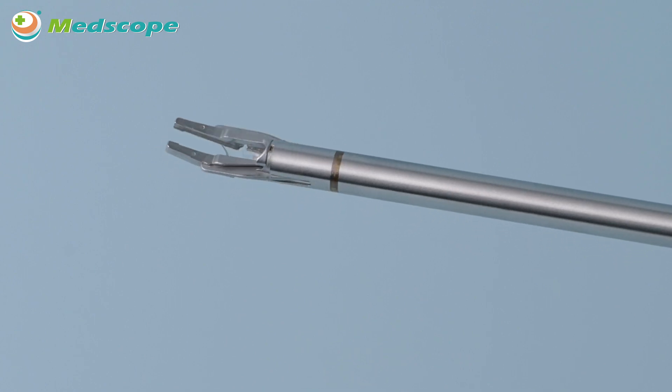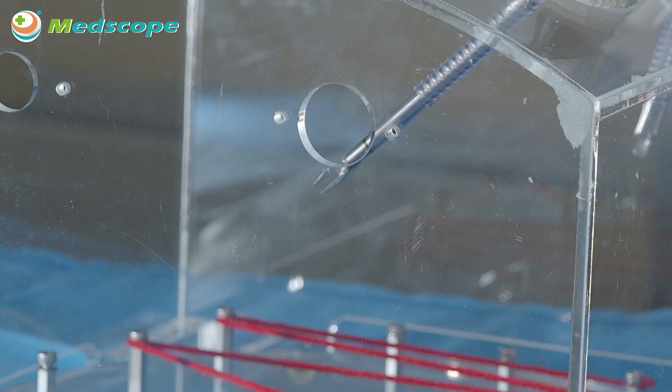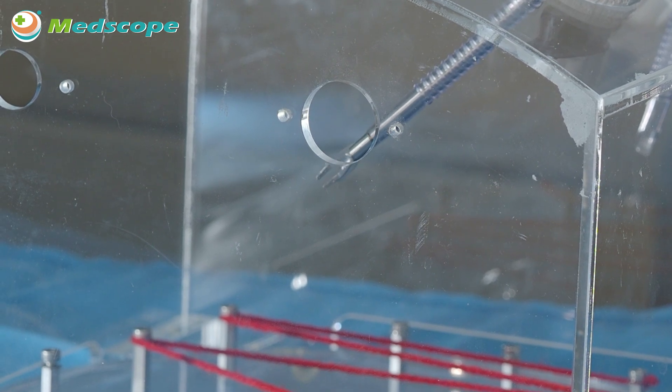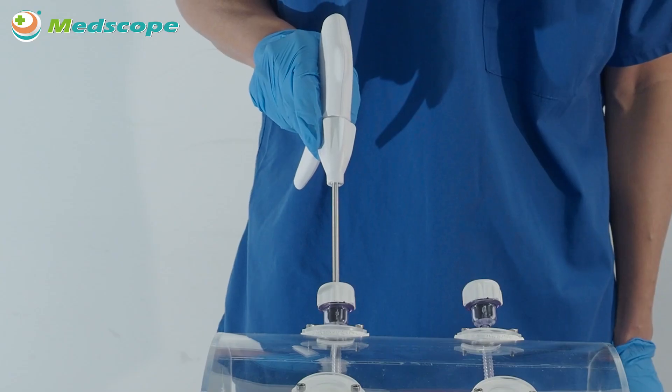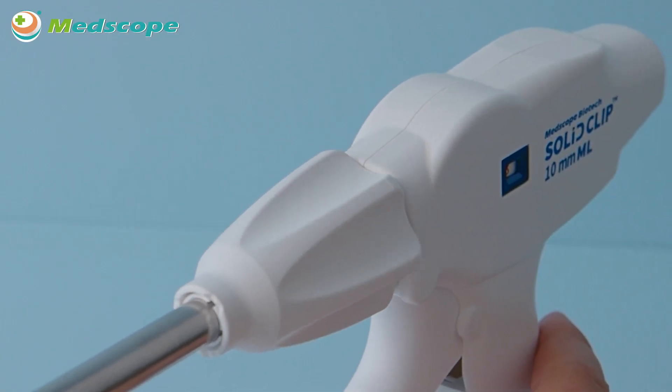Make sure the indicator line comes out of the trocar. It is required to confirm that the indication line on the shaft is fully visible prior to firing the clip, to prevent interference while the jaw is active. The rotation knob can be rotated 360 degrees in any direction to ensure the visibility of the jaw.